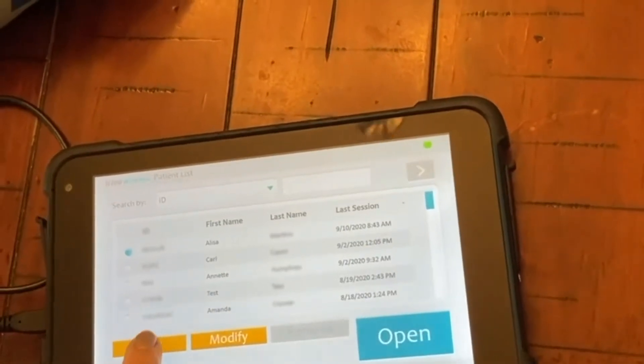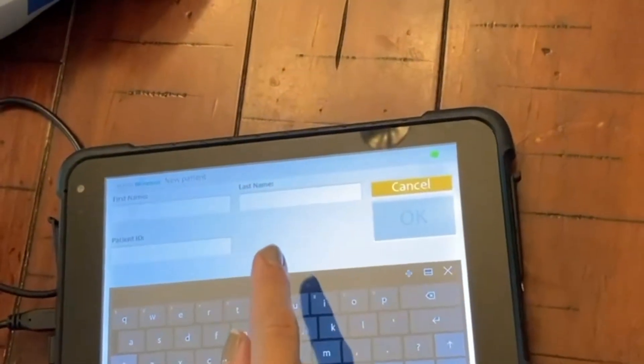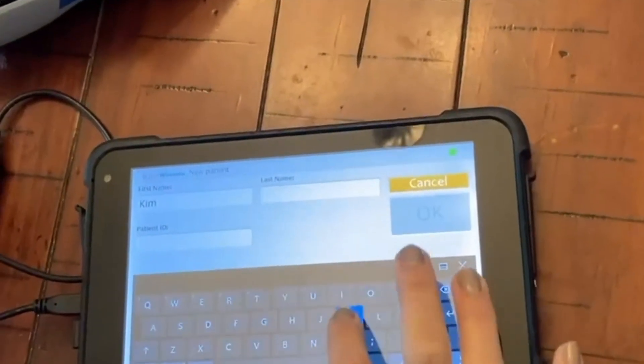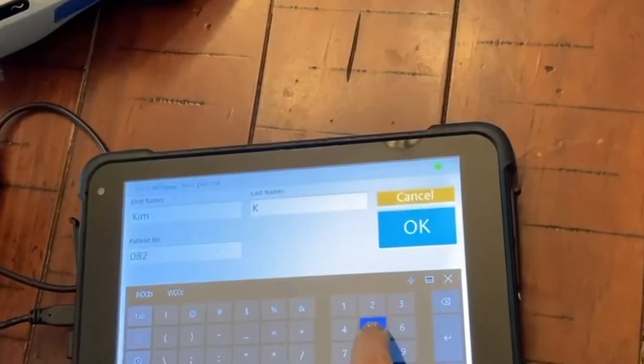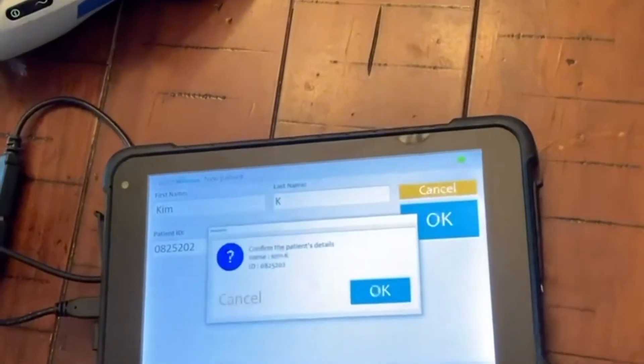Hit New to add a new patient. You'll need the new patient's first name, last name, and a unique patient ID. Press OK when you're done.